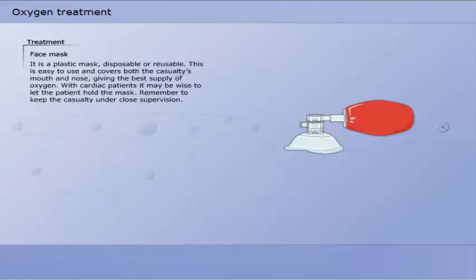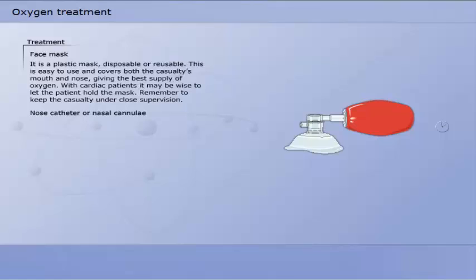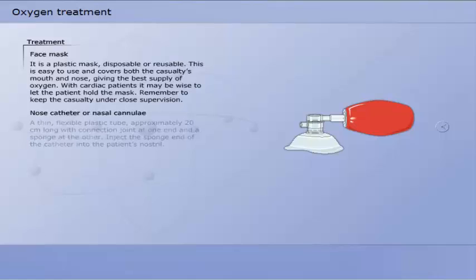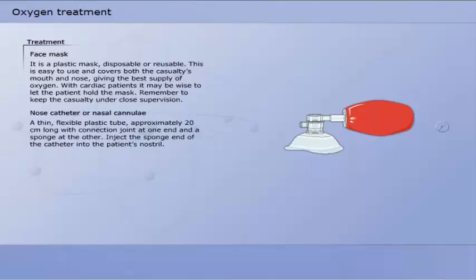A face mask is a plastic mask, disposable or reusable. This is easy to use and covers both the casualty's mouth and nose, giving the best supply of oxygen. With cardiac patients it may be wise to let the patient hold the mask. Remember to keep the casualty under close supervision. This procedure may make the casualty anxious and he should therefore be reassured by the first aider.